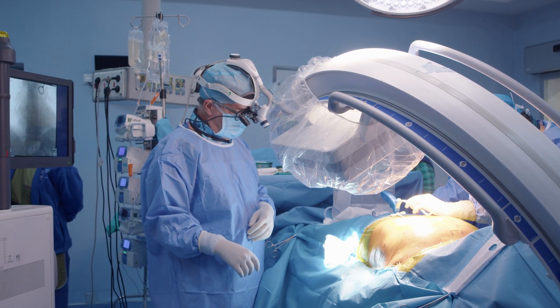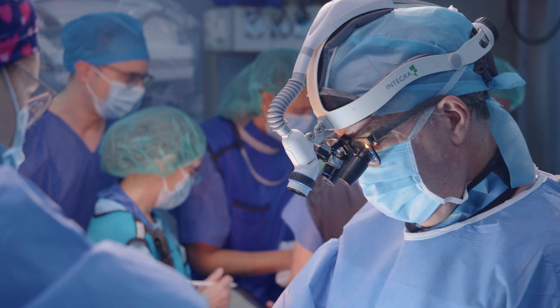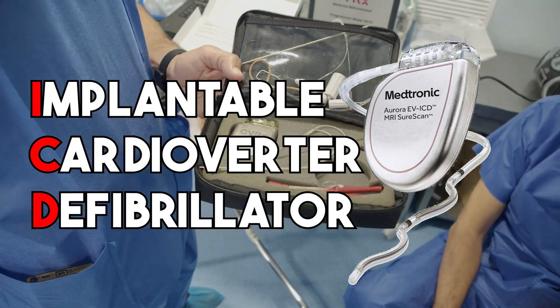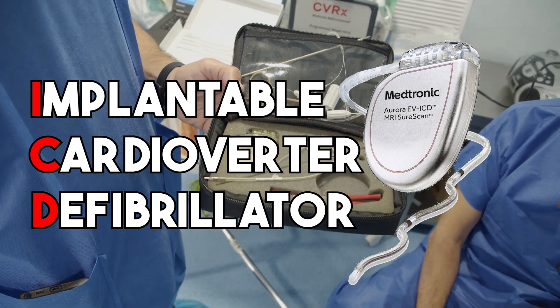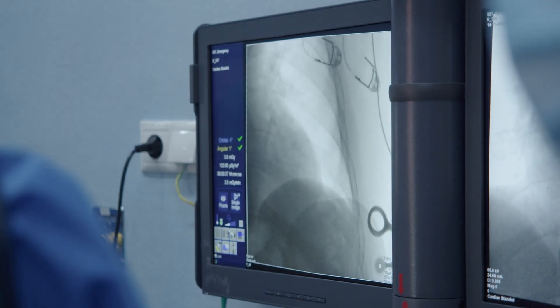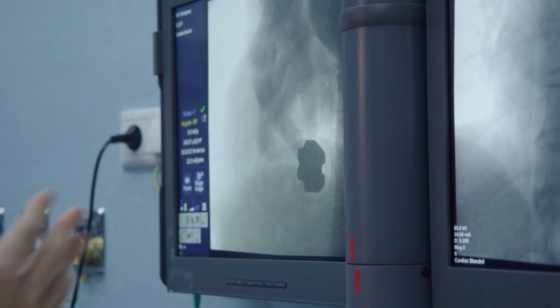Let's dive in and discover how this remarkable technology can save lives and improve the quality of life for many individuals. The implantable cardioverter defibrillator, or ICD, is considered a life-saving device. It continuously monitors the heart rhythm and provides therapy for life-threatening arrhythmias through its electrical system.